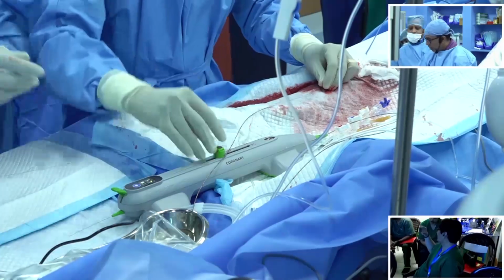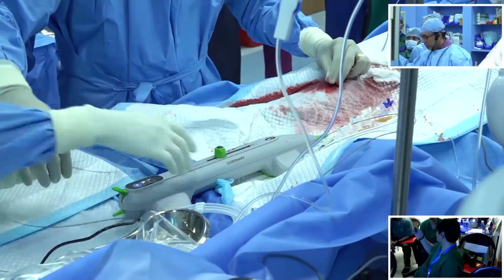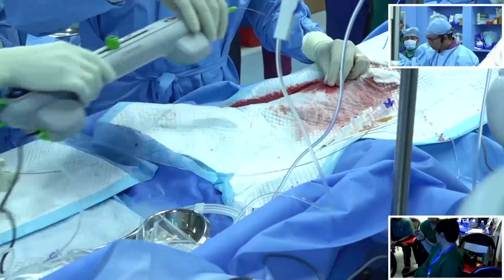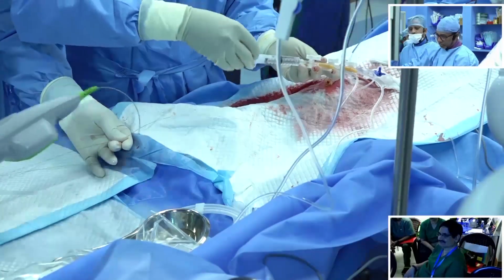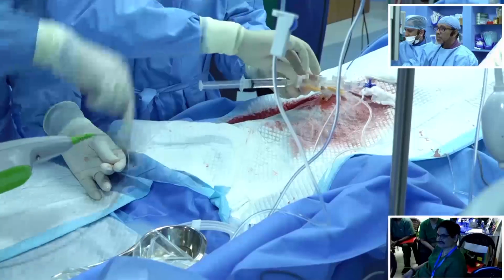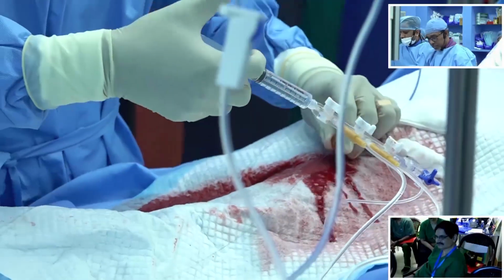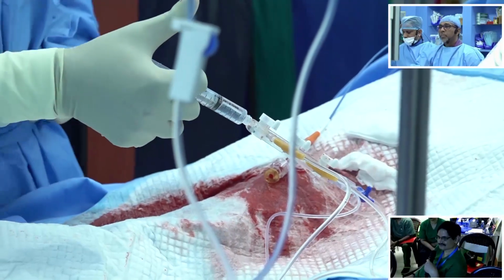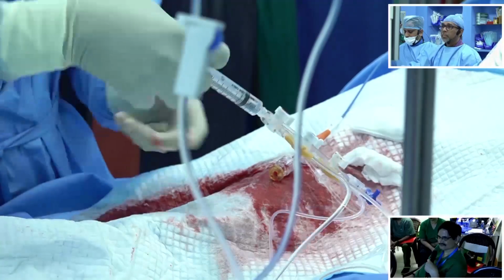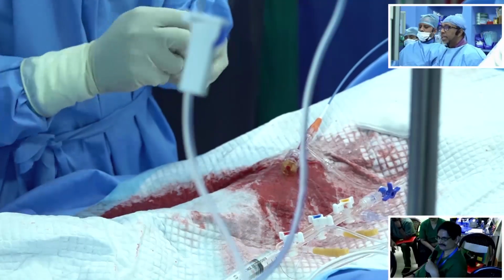Now we'll take this out. Now the wire. Give some nitro also.